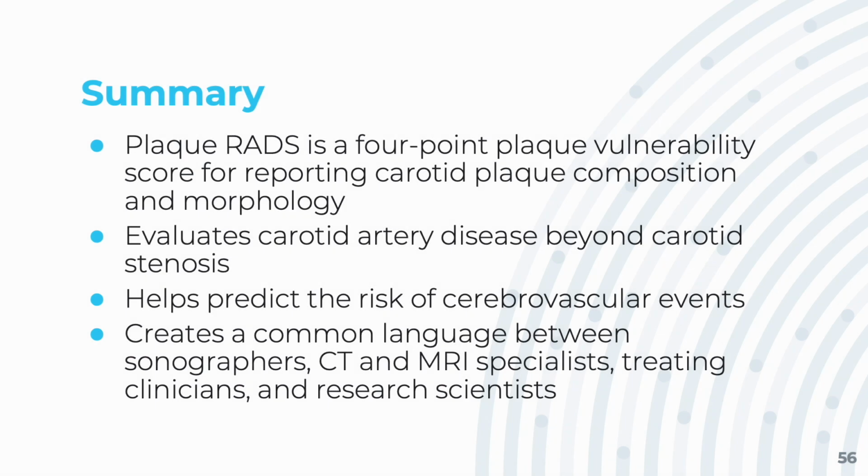In summary, Plaque RADS is a 4-point plaque vulnerability scoring system, and it allows us to report carotid plaque composition and morphology. And it gives us an opportunity to evaluate carotid artery disease beyond carotid stenosis in order to help predict a patient's risk for future stroke events.